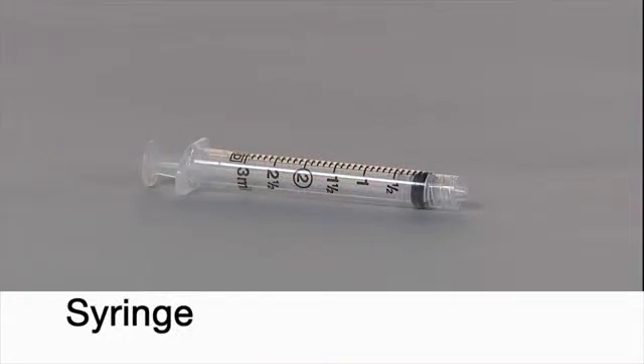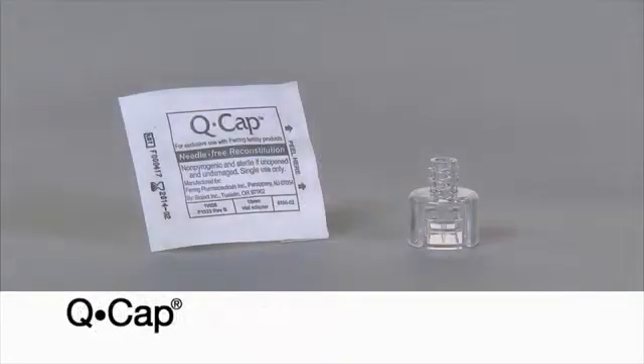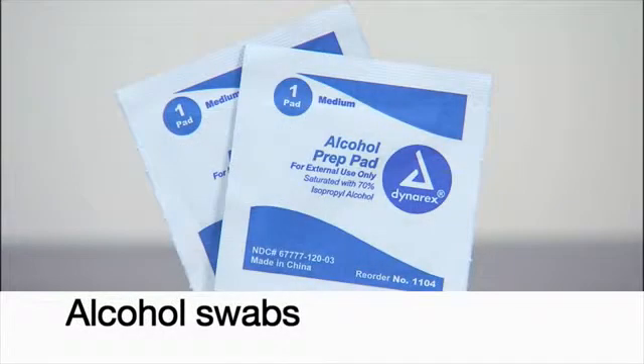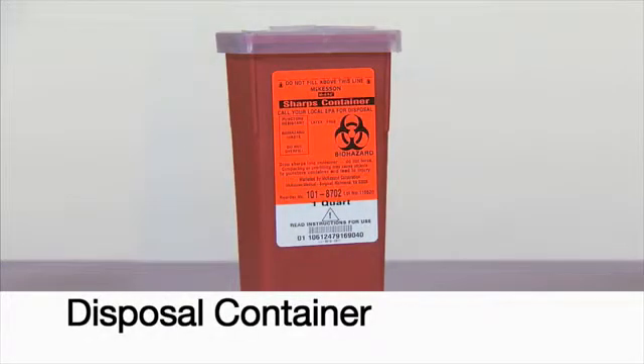Gather one sterile syringe, one subcutaneous injection needle, one Q-cap vial adapter for needle-free mixing, alcohol swabs, gauze, and a disposal container.